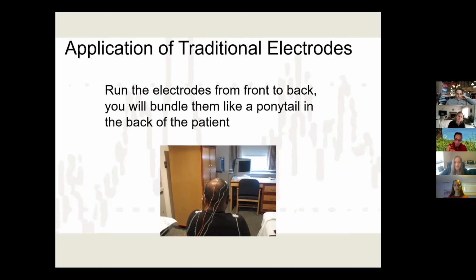Okay, does anybody have any questions about actually putting the electrodes on? When I was going through the paperwork that we have, I noticed some of them never had a specific spot where they told you to make the first cross, but they were indicating that you were making a second cross already. So I wondered if, when you were measuring circumference, you just automatically assumed you have to make crosses for certain ones. Yeah, so on the worksheet, there are some that tell you make a cross here, and you do that because, you know, later in the hookup, you're not going to come back around on some measurement and cross it.